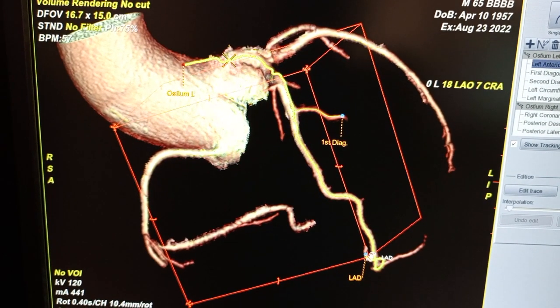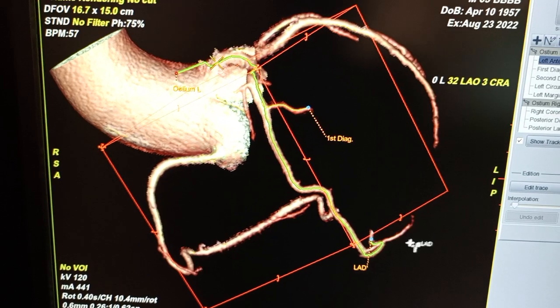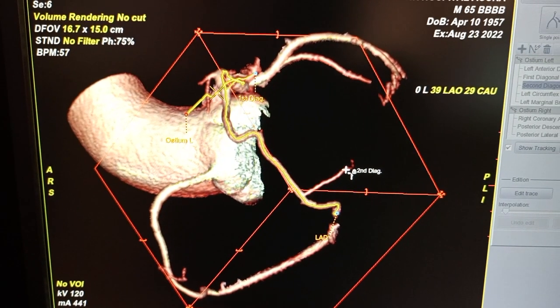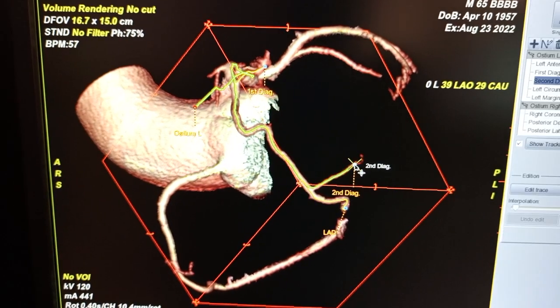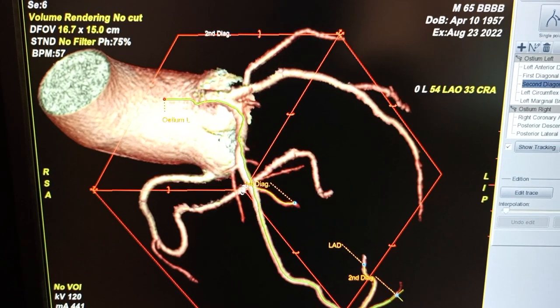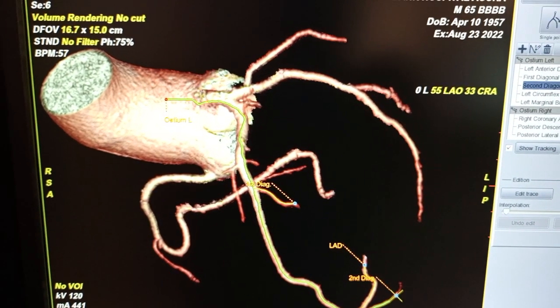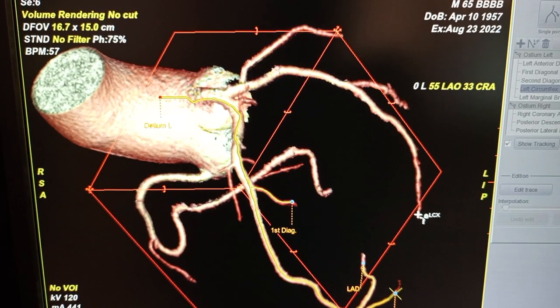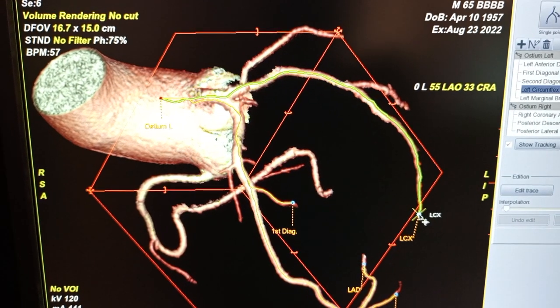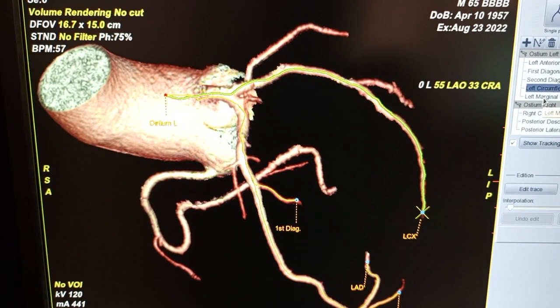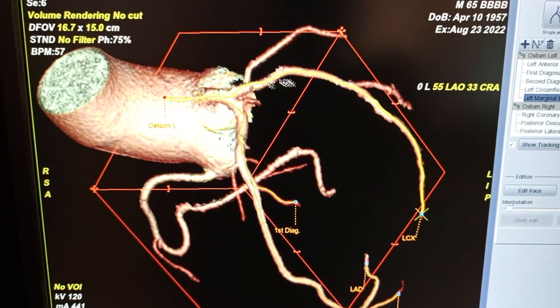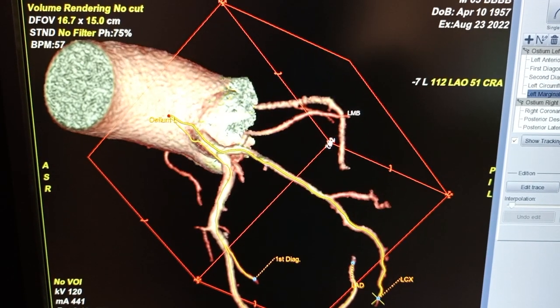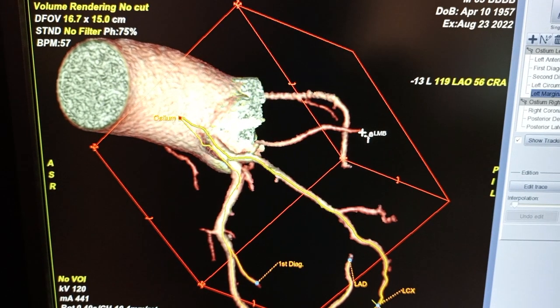Let's see if we get something down there — this is the second diagonal. Now let's click on the left second circumflex flex. It's being tracked. It is done. We have the marginal — you can see this vessel is coming out from the left second flex, so that is the first marginal, the left marginal branch.